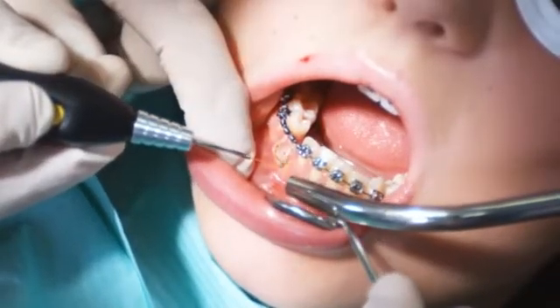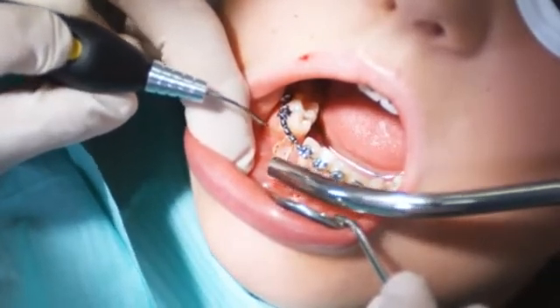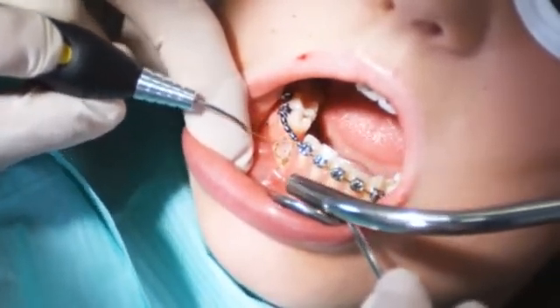After the tooth is exposed, you can rework the margins as needed to prepare a sufficiently large tooth surface for attaching the bracket.